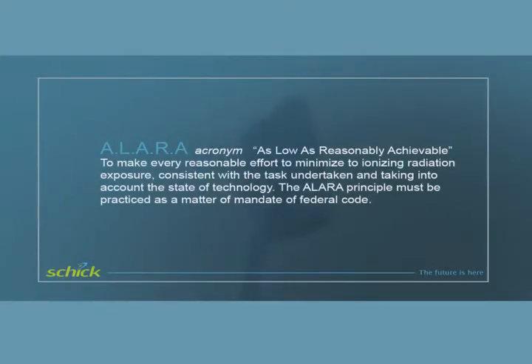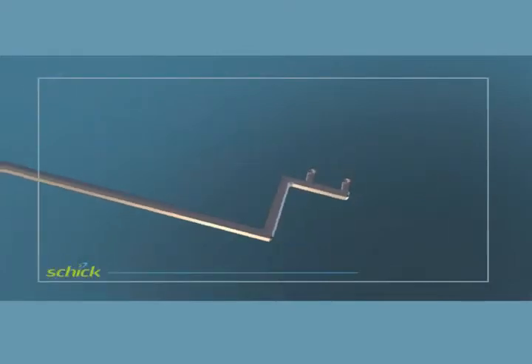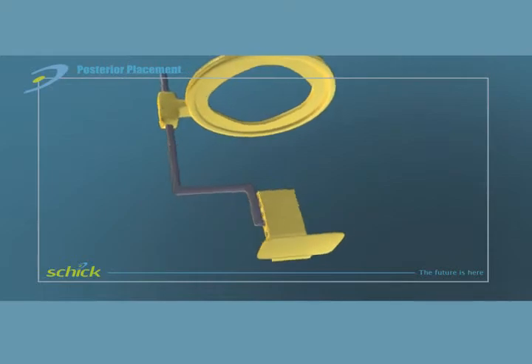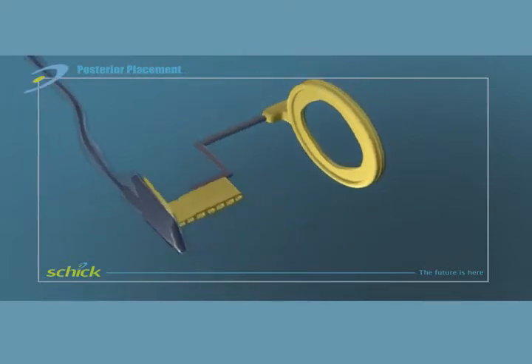ALARA, an acronym for as low as reasonably achievable. Every dentist has responsibility for keeping patient and staff exposure to radiation ALARA. This means making every reasonable effort to minimize exposure, consistent with the task at hand, and taking into account the state of technology.